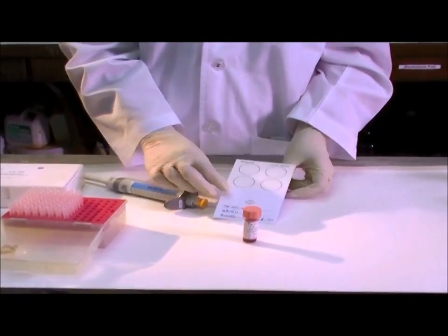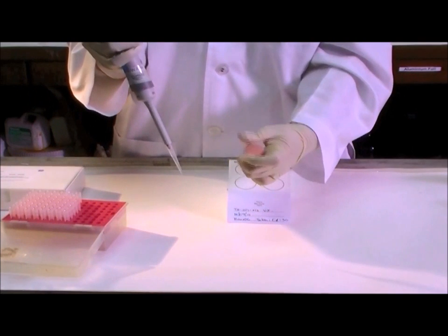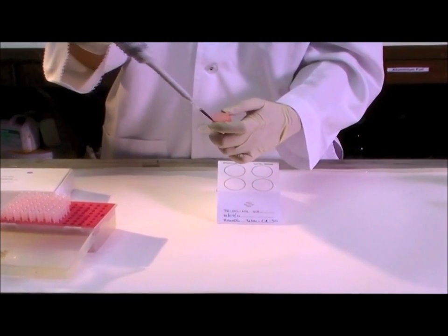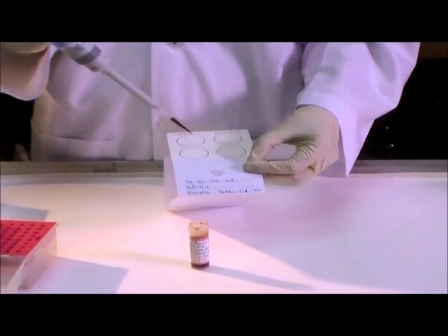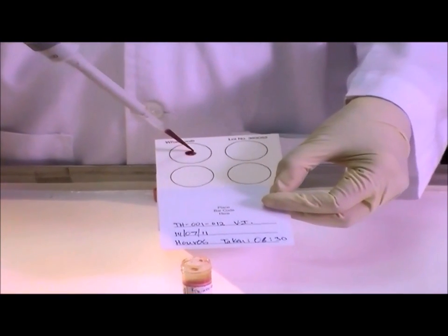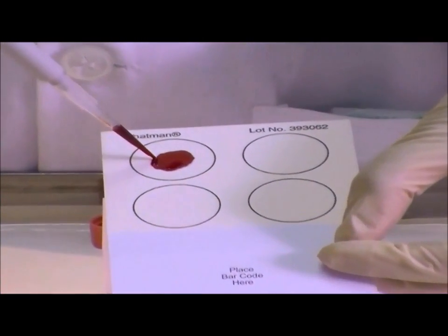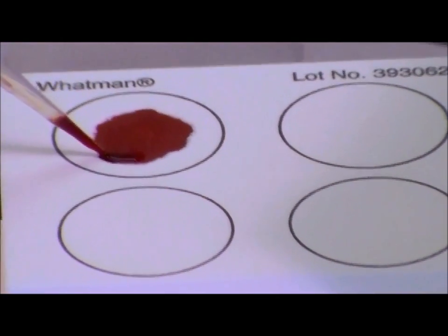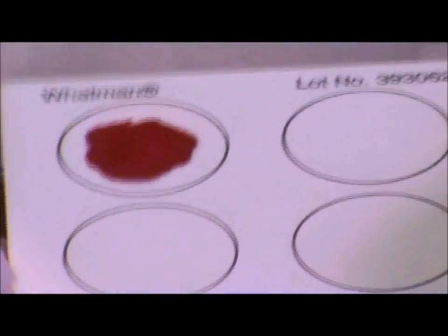If pipetting from venous blood draw, apply 100 microliters of blood to each of four circles, totaling 400 microliters. For each circle, begin at the center and move out in a spiral. Make sure the card is suspended while applying blood so that blood does not reach the back of the card.